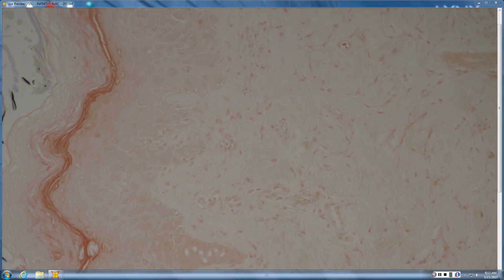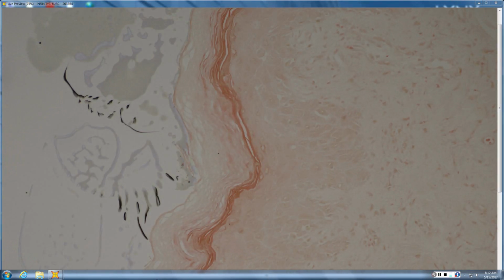That's really bad. We're acral. We're subacute. You can see that zone of red. There's an interface dermatitis that's vacuolar, and there is some epithelial disorder that's squeezing a lot from this particular slide. But this was a toxic erythema of chemo, an acral erythema. It's been described as looking like grade 1/2 GVH.